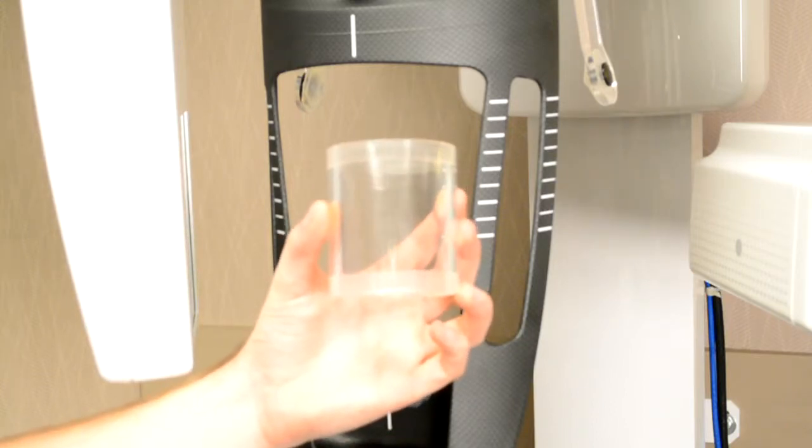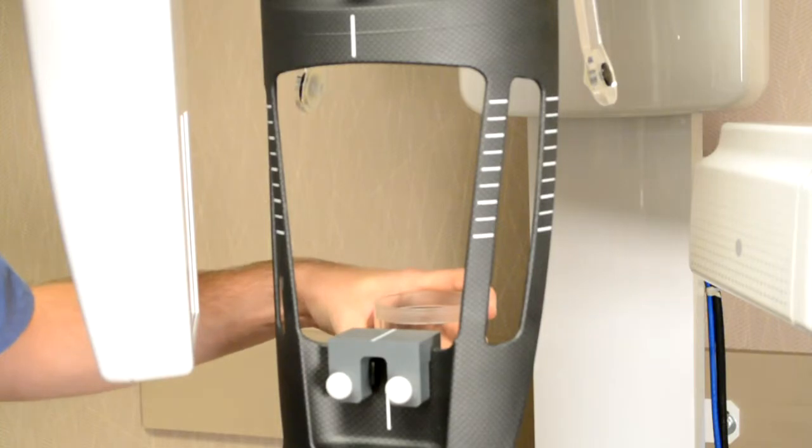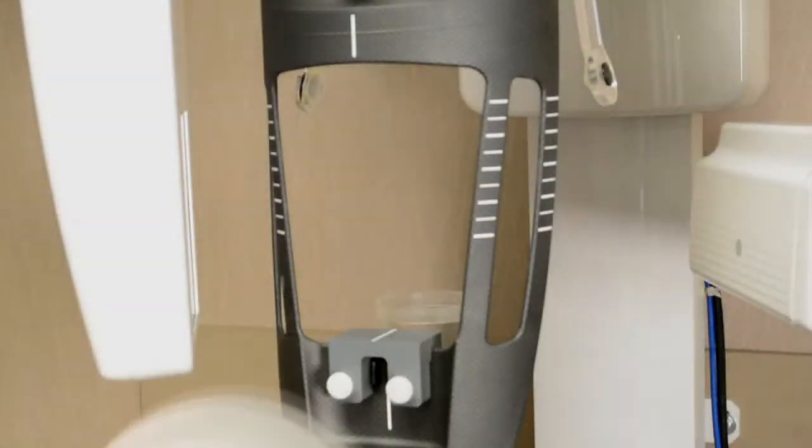Position the transparent cylinder onto the main support piece. Position the 3D test phantom on the transparent cylinder.